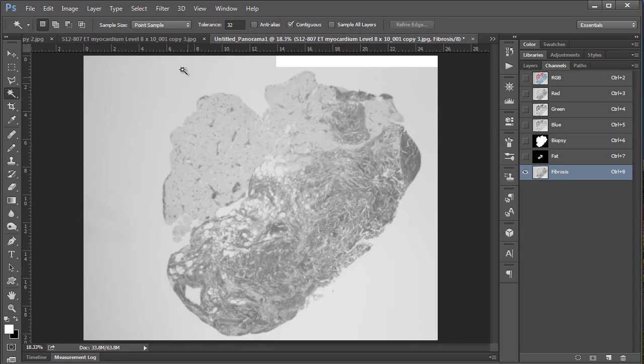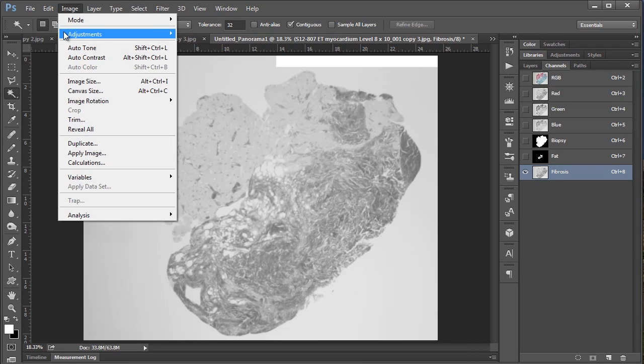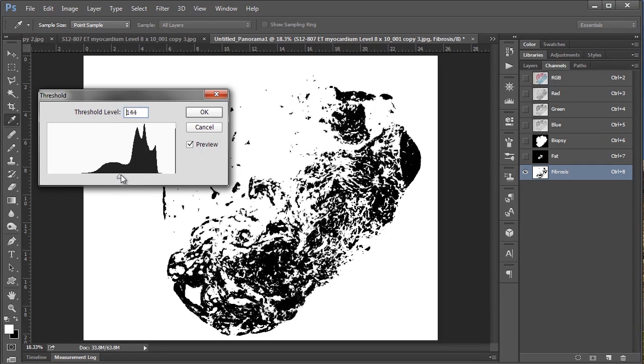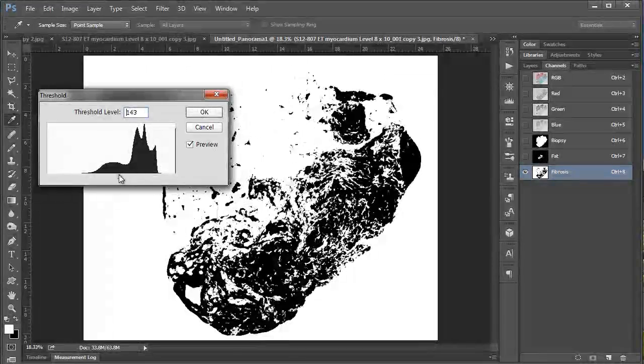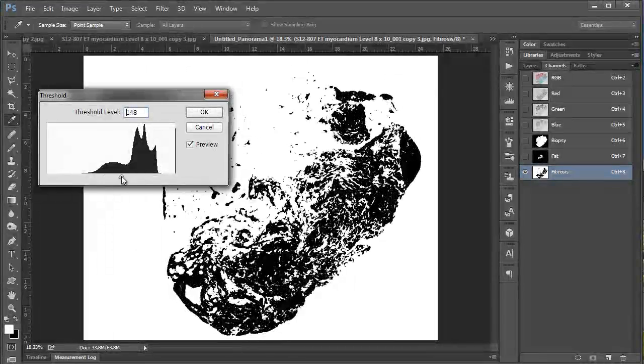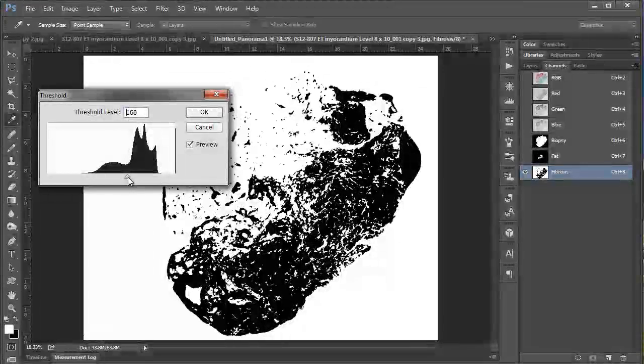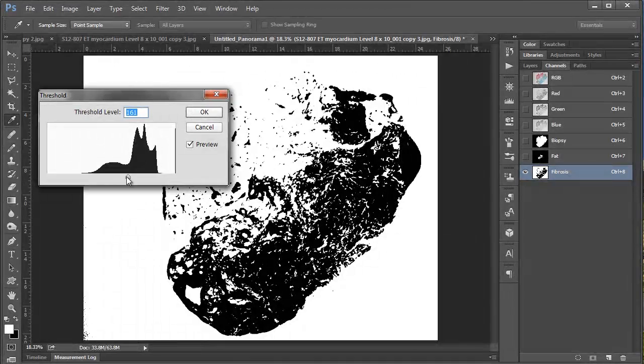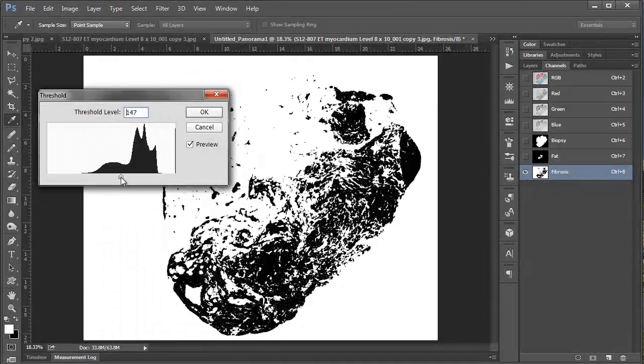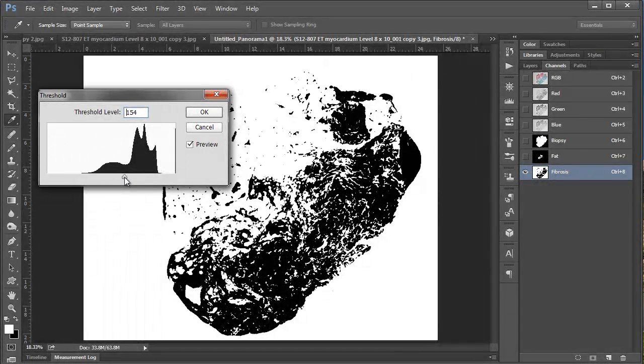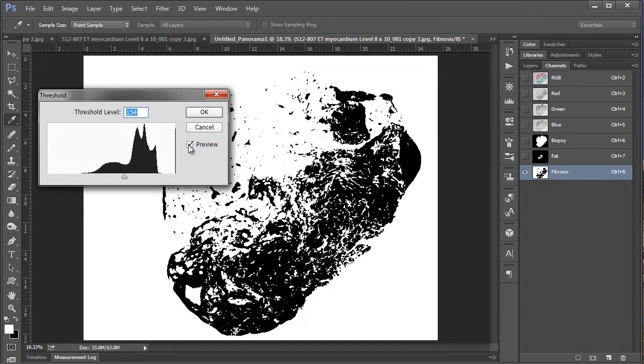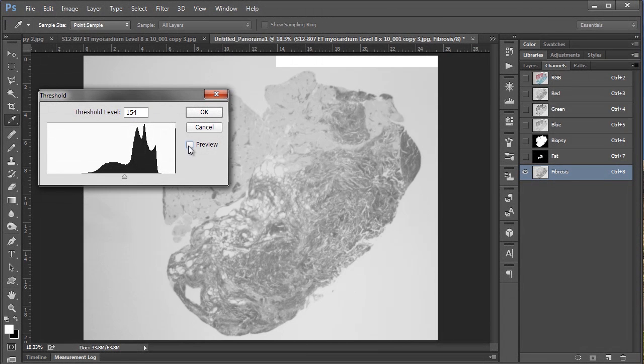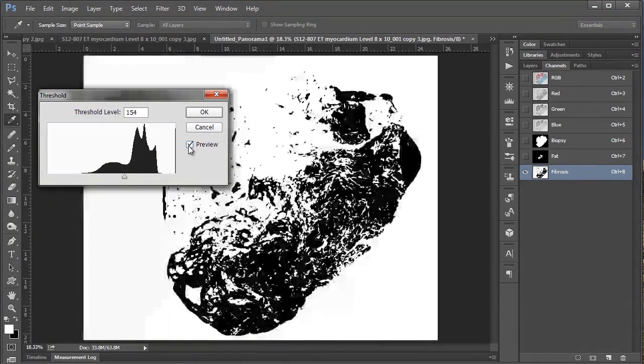So to do that we're going to use the threshold command. And you can get to that by going to image adjustments and down to threshold. And so basically what this does is all luminosity information, or basically the lightness or darkness of your pixels, will either be converted to black or white depending on their value represented by this histogram. So generally you just want to slide this little slider around until you have what looks like a pretty good selection. And you can look at that and you can see where you're at by clicking this preview check box and sort of seeing what's selected.